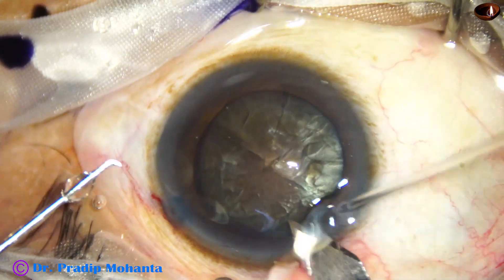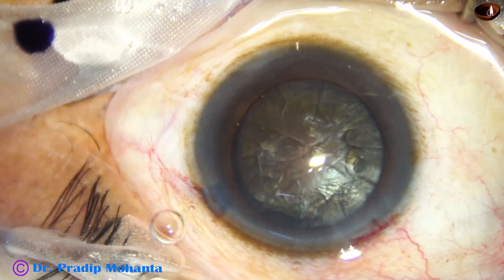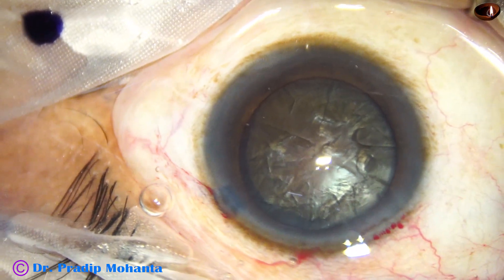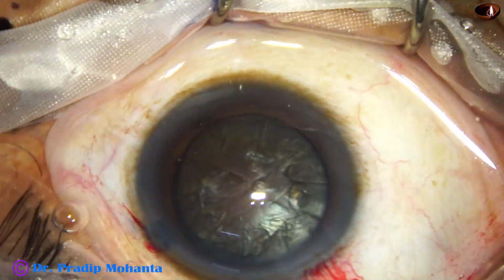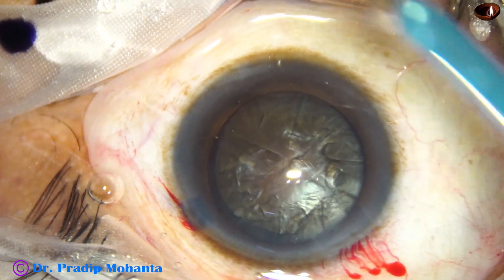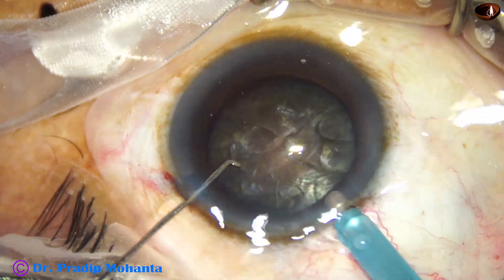Before that, I am going to enlarge the main wound by just a very small cut. This is to ensure that there is enough leakage of BSS through the main wound so that the tissue remains cool and there is no wound burn. Now I am going to expose the tip of the FACO needle to about 2.5 to 3 millimeters so that I can apply more ultrasonic energy within the substance of the nucleus.